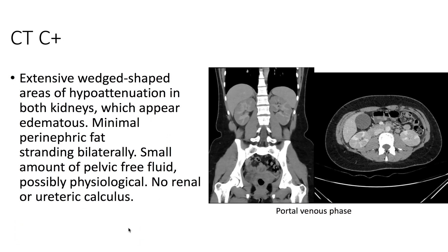Taking a look at the CT of the abdomen and pelvis with contrast, here the portal venous phase, we see that there are extensive wedge-shaped areas of hypoattenuation in both kidneys. These areas appear edematous. There is minimal perinephric fat stranding bilaterally, and there are no renal or ureteric calculi.